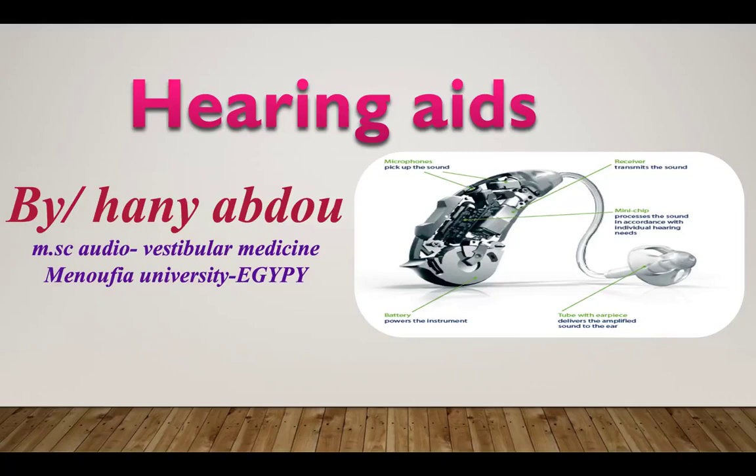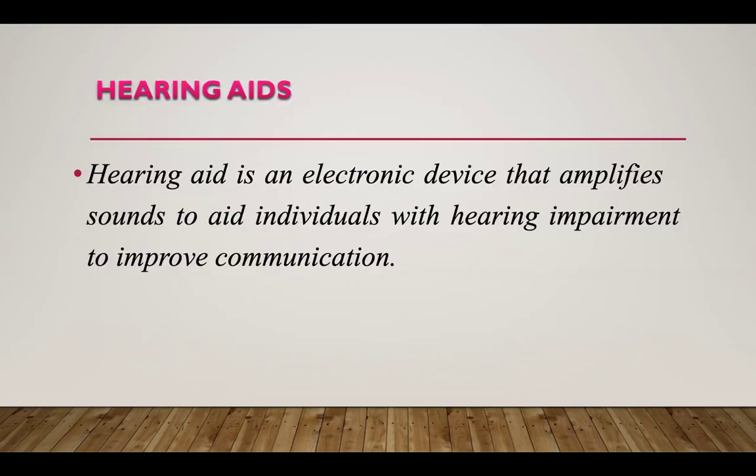My presentation today is about hearing aids. First of all, some slides of this presentation were taken from Dr. Abdessamna's presentations about hearing aids. So, let's move on. First of all, what is a hearing aid? A hearing aid is an electronic device that amplifies sounds to aid individuals with hearing impairment to improve their communication.